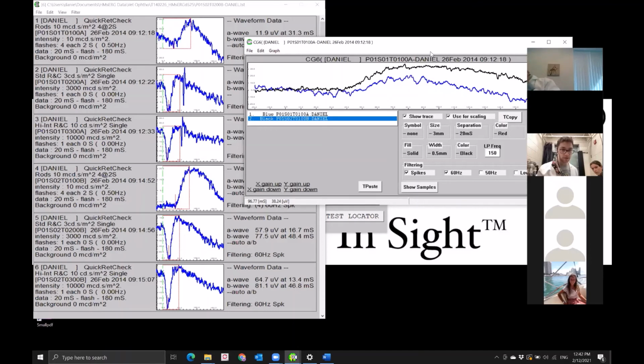So how long do we keep the mouse in the dark room before conducting ERGs? Typically I hear overnight, 8 hours being what most people do as a standard. And I think that probably makes the most sense. Most importantly, whatever you do in your lab, do it consistently. If it's 10 hours for one group and you're coming back to test them again, do the same 10 hours. Try to keep all those variables as low as possible. Try to be consistent. That will yield you better data.